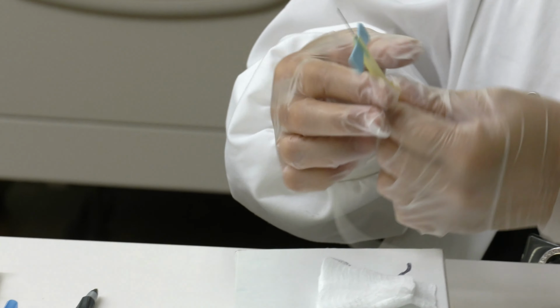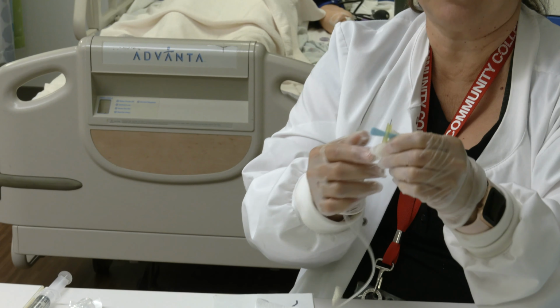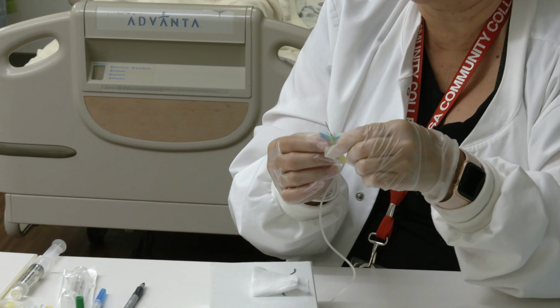And then when you're all done, you take your 2x2 and you just pull back out again. All right. These have that lovely little safety condition, so if you pushed up, it'll click and hide the needle, and so you wouldn't risk poking yourself later.